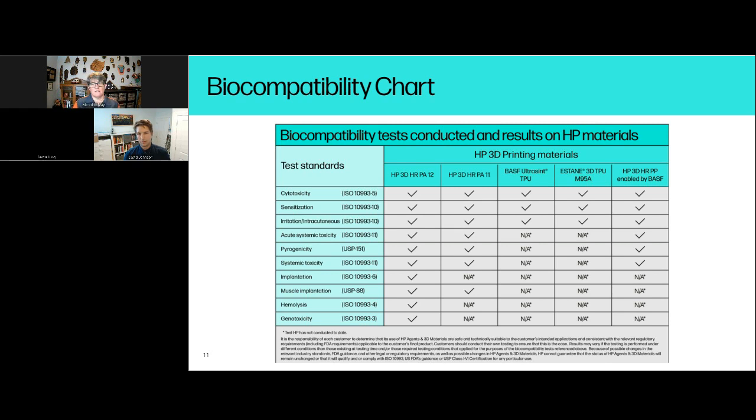So if these are done right off the printer, then the question will be what manufacturing materials or chemicals are coming in contact with your device after it comes off the printer. And you're right, bead blast and some of those things can definitely have a bit of an impact, but you just have to evaluate the details of what the media is, how it's maintained, how much you're recycling it, the same kind of thing that you're having to do for your powder. As long as you have strict controls and you know exactly what's going to come in contact with the device, you should be able to write some justifications and possibly shortcut some of the testing.